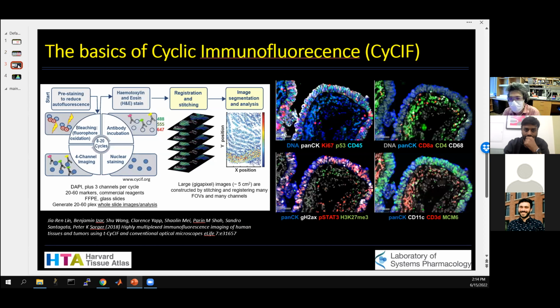Sorry, that's kind of a long introduction for everything, but now we tie back to CYCIF. And CYCIF, I think maybe some of you heard about that, but it's similar to what you do with CODEX, right? I think CODEX has now become a more popular approach, but the same idea: you can do this kind of cyclic staining. So in each cycle, you only stain a given number of markers. Here, we use 3 markers in one cycle.